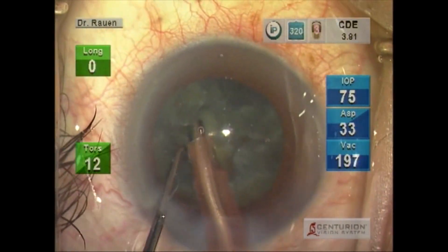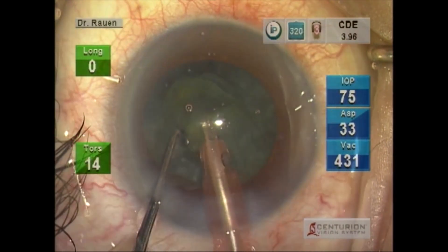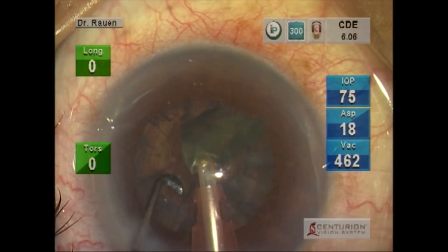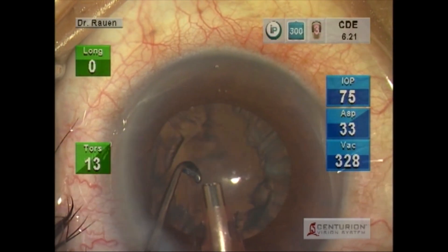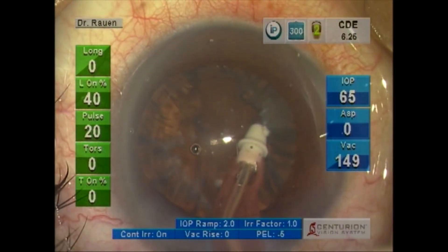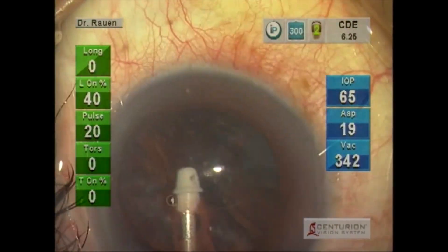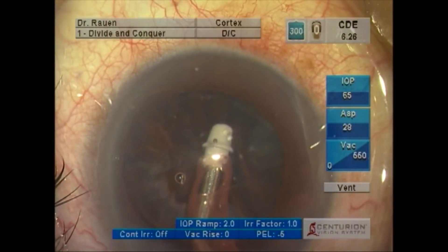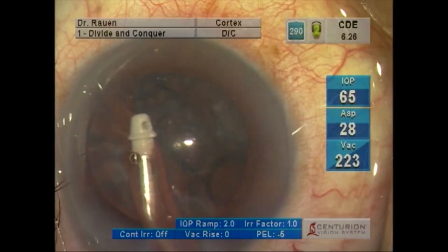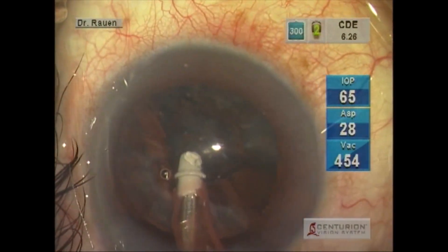There is very great followability because of the excellent fluidics and very efficient removal of nuclear pieces. Again, this patient had a history of Flomax use, and you just see very little bouncing of any of the structures. The strength of the fluidics is carried throughout the procedure.